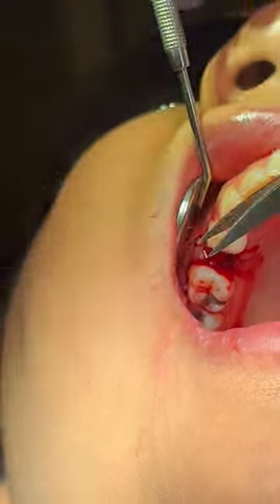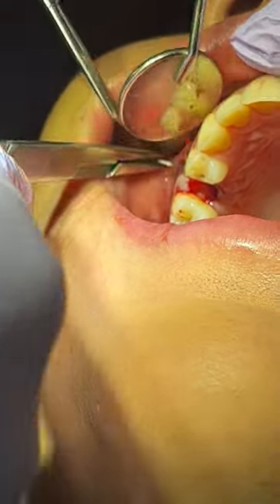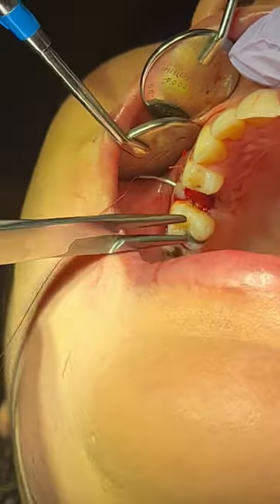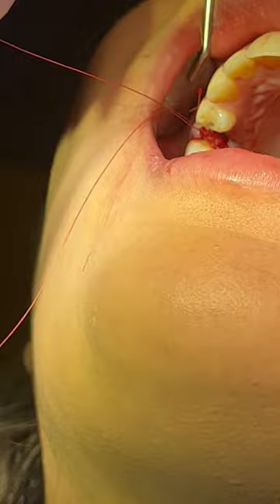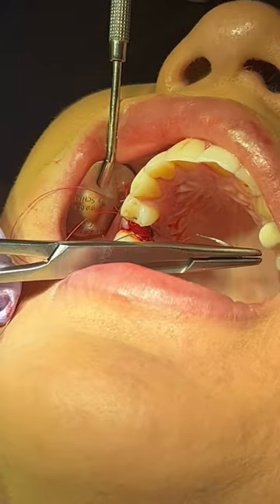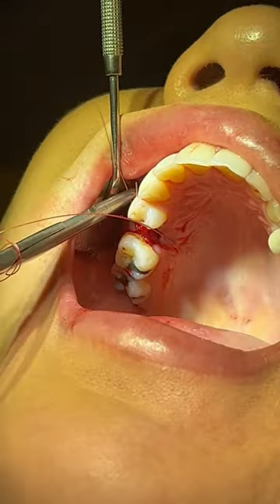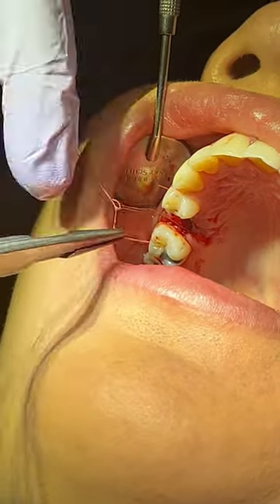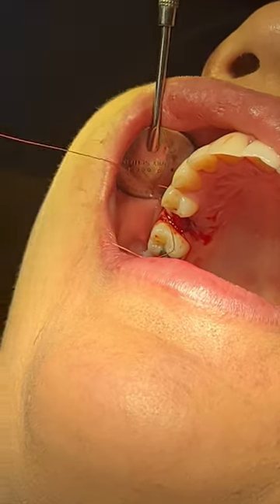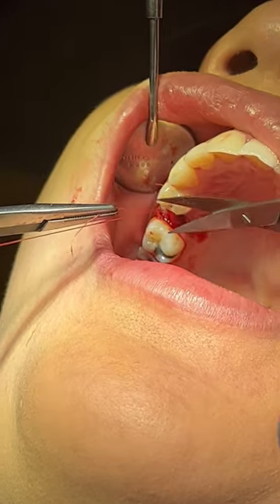The suture and throw technique I like to use is 2-2-2, where after I'm tying everything down, I take two reps going counterclockwise, then clockwise, then back to counterclockwise. Some people like 2-1-2 — two counterclockwise, one clockwise, then two counterclockwise again. Whatever works for you. As you can see right here, I take two, tie it down, hold it down, then take another two going the other way, tie it down, hold it down, then two more. It's just what I've done forever and it works for me — whatever works for you, please continue to do.